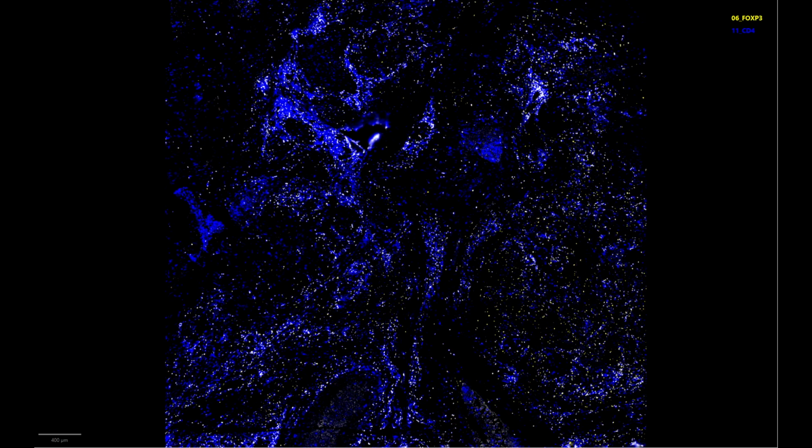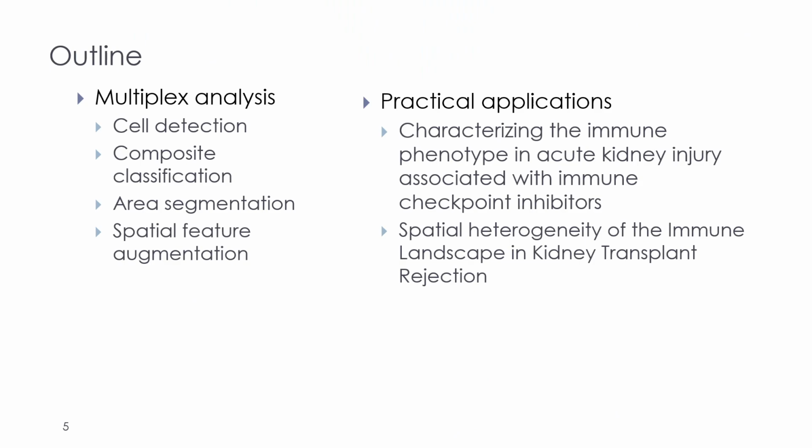So it's easy to get overwhelmed with the volume of data generated from multiplexed IHC studies, and attempting to visualize all markers simultaneously won't really yield any meaningful information as shown here. But by meticulously designing a multiplex workflow to profile specific combinations of markers and cell types, you can address and evaluate distinct spatial relationships between cells in their native spatial context. Some combinations can include proliferating tumor cells, activated T cells, macrophages associated with immune suppression, and regulatory T cells, to name a few. In this webinar, we will walk you through an example workflow from a recent project done in collaboration with the team at Fortis, and then show the practical application of such workflows from our published studies.